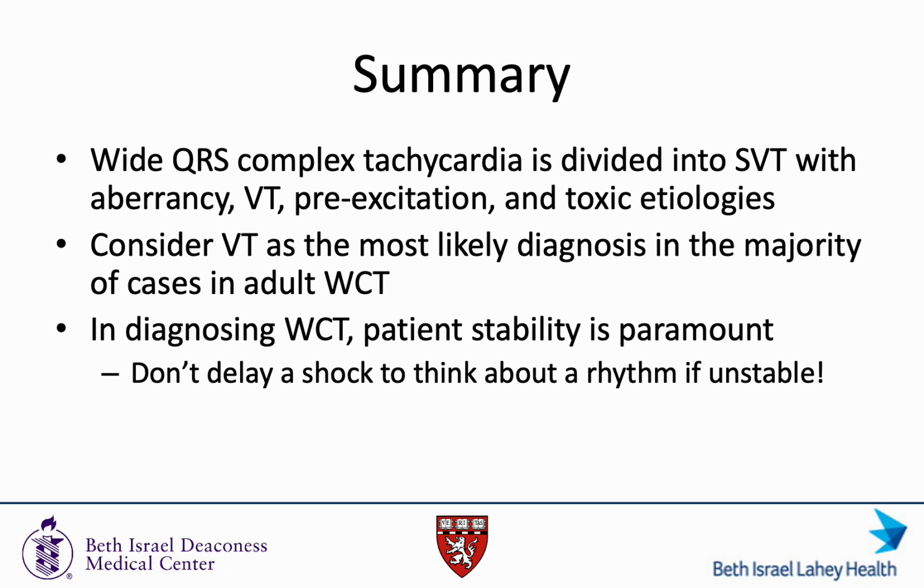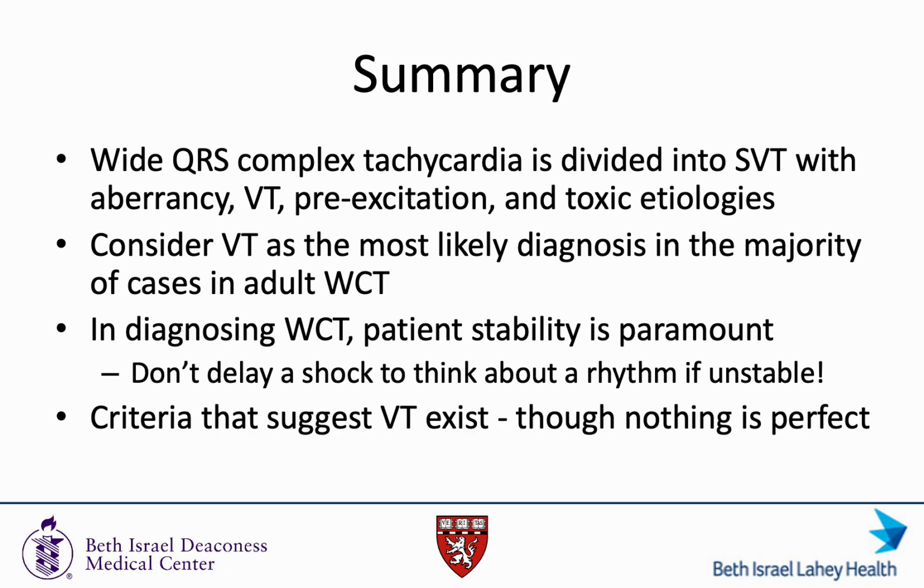And finally, as we've discussed today, there are criteria that suggest VT that you can use to help you, but nothing is perfect. Sometimes the only way you'll get a true answer is with an EP study, and that's okay.